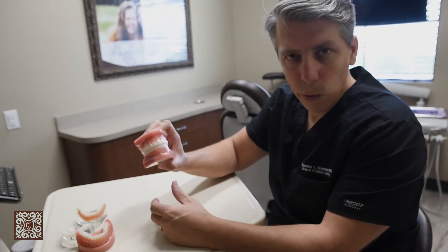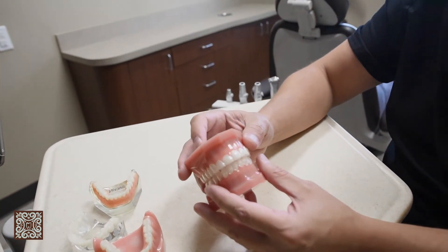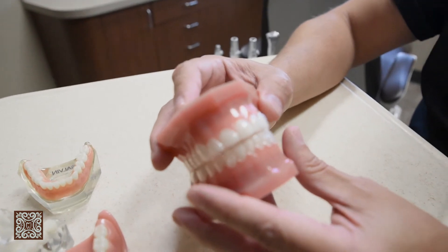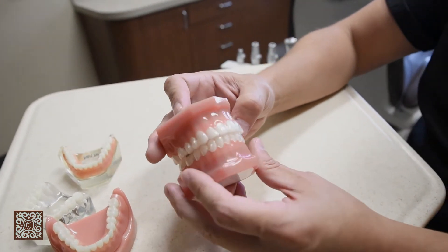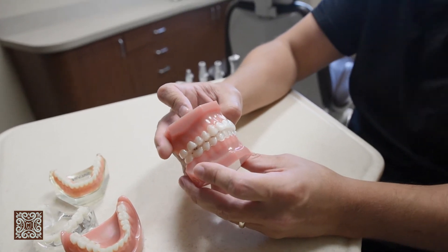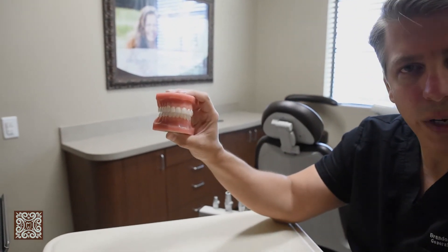This model is an example of something really popular these days — this is called Invisalign. Invisalign is orthodontic movement of teeth without braces. We use these clear trays that level and align teeth. And if you take a good look, it's really hard to tell if you're wearing the trays or not.